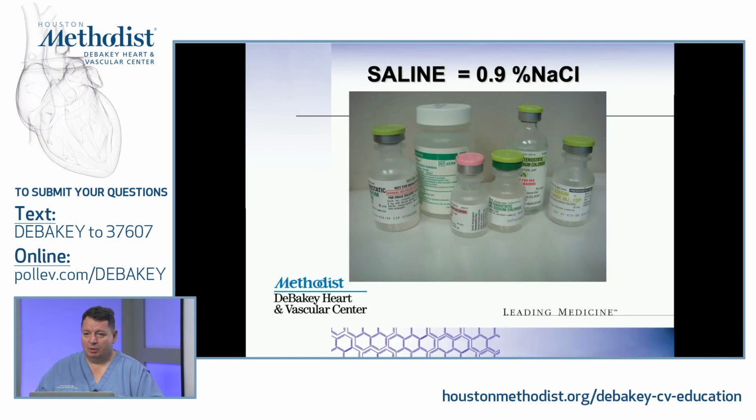I wanted to tell you more about the bubbles. So these are my bubbles, and these are my collections. And what happened is that one day we will see a case report why we thought that the bubbles are also very important for this part of the protocol.